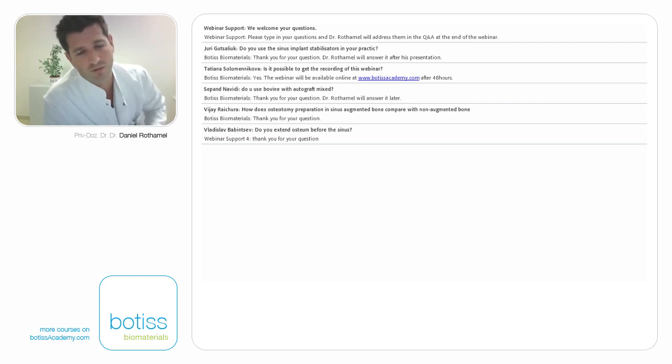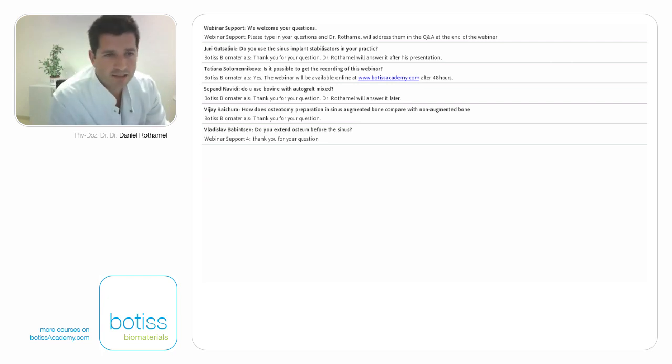Sometimes during the surgery, you can see that there's a little artery inside the bone, or even on the inside of the bone, that needs to be cut. Then sometimes you see some blood coming out of it. So in our department we have electric devices to coagulate the arteries, so we don't see any big problem. It is different when you perform it without access to a bipolar device.